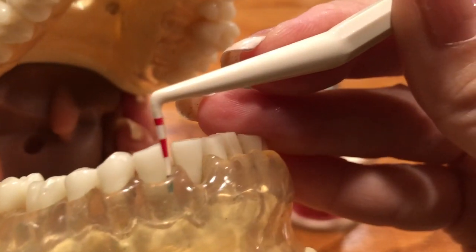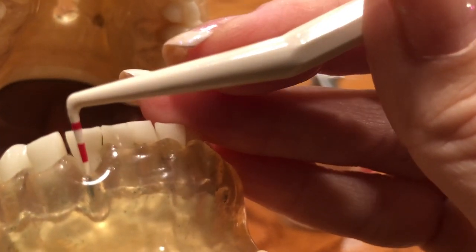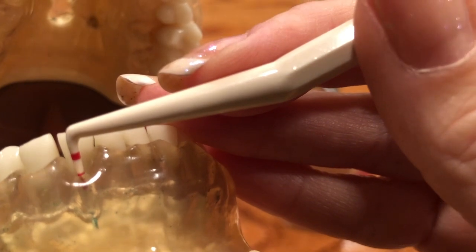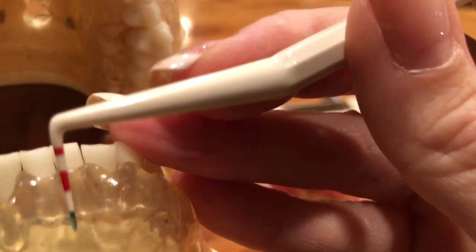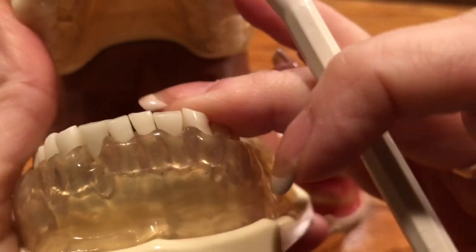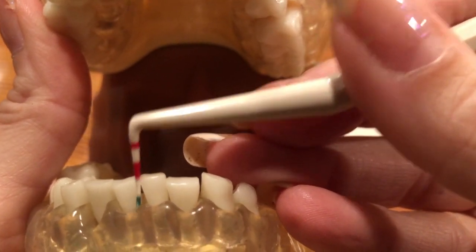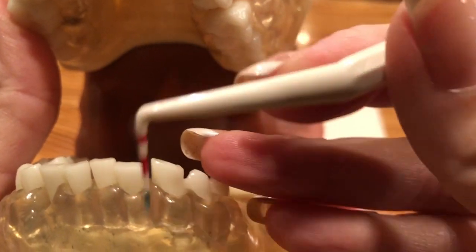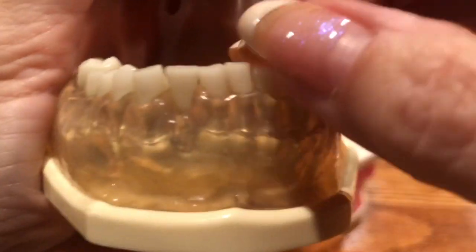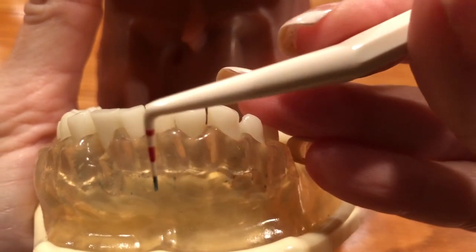Oops, I'm moving it. 3, 2, 3. 3, 2, 3. So you can see this is obviously a deficit. This is going to be more like a 6 to this bone here. So your hygienist is going to measure to where the bone level is here. But I'm just kind of showing you the 3, 2, 3 and not making it all be diseased like here, 6, 6, 6. So where you've had bone loss, if you have bone loss like this, your teeth are more than likely going to be loose when we wiggle them because you've lost this much bone.